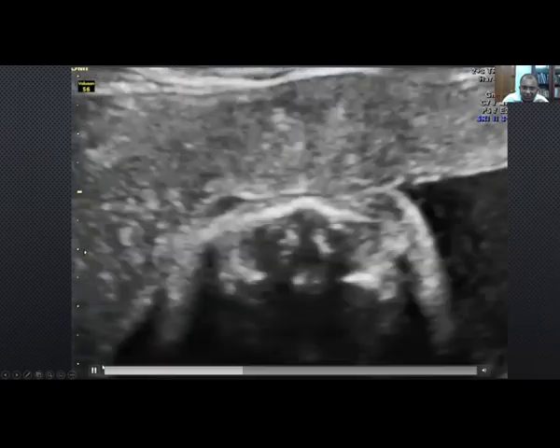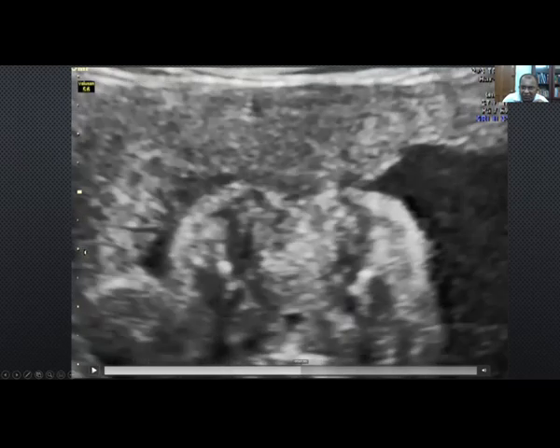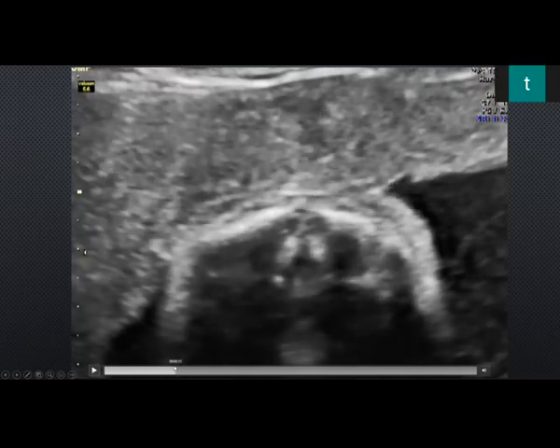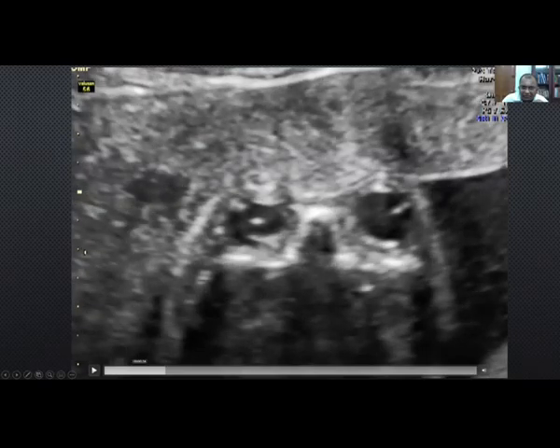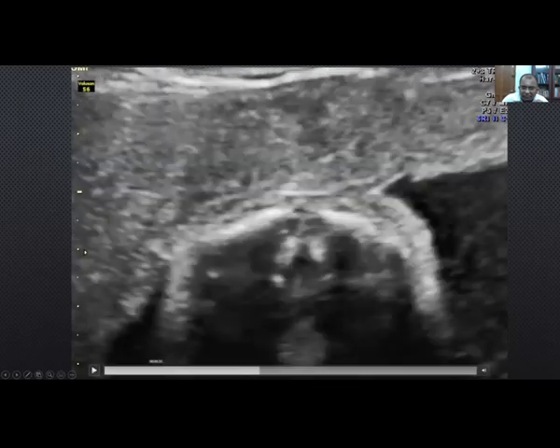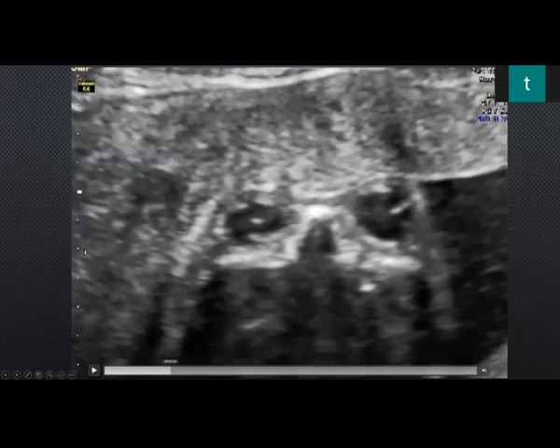As you can see over here, it's not just to see the presence of the orbits, it's important to compare the orbits. You see this? The shape of this orbit and this orbit. This looks a lot more normal, not more convex. We just move it against it, as compared to this, which is a lot more flat.